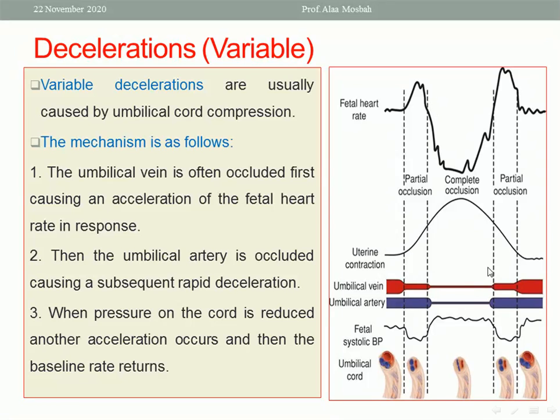Then the umbilical artery is occluded, so there is rapid deceleration. So umbilical vein occluded, there is acceleration. Umbilical artery occluded, there is rapid deceleration.